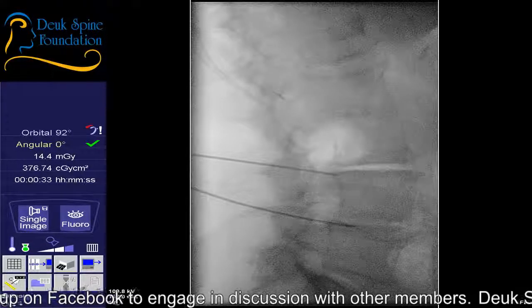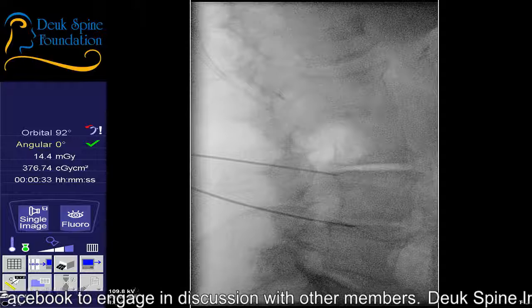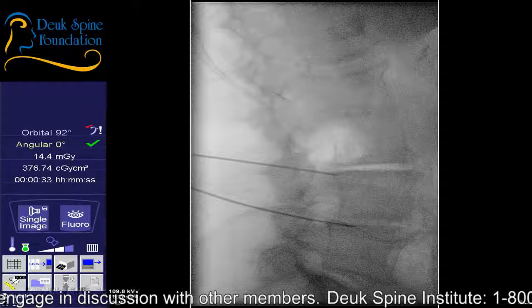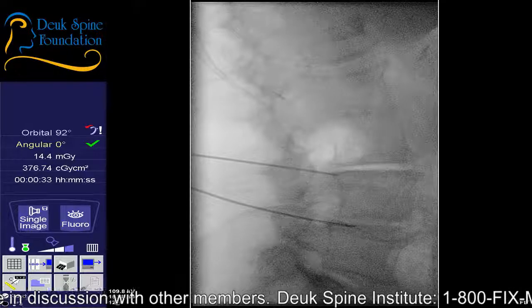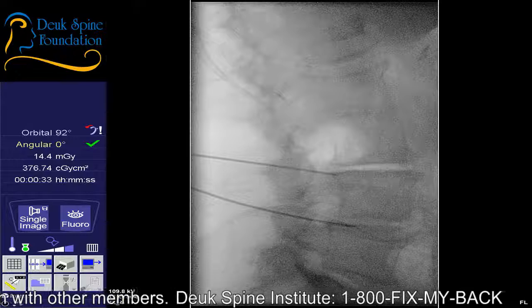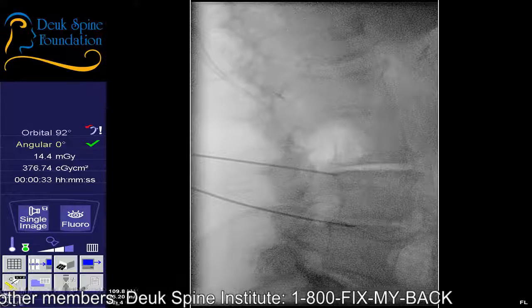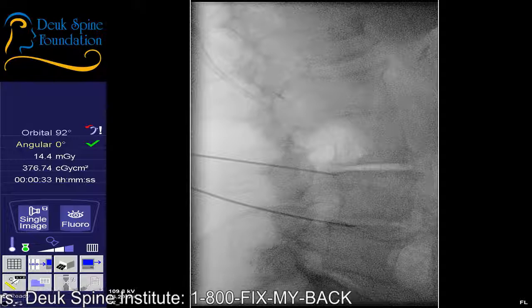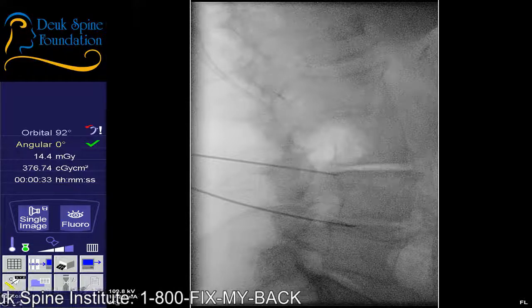It seems to be better. I believe that is better. That is better. Okay, so you can see that I'm low in the foramen. You can see the facet joint is massive. And you can see that we need to be a little bit higher. So that's why having the right view on the fluoro is so important.